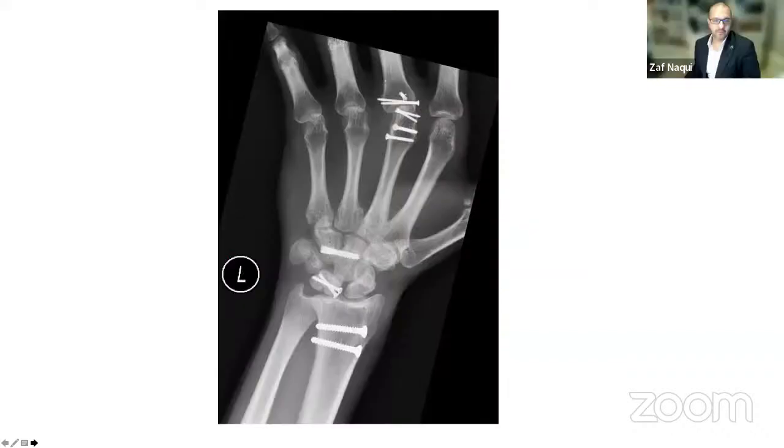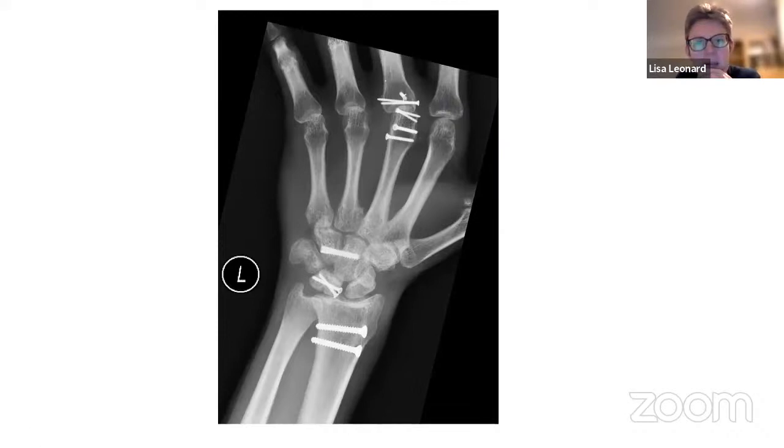So here we go. This is what was done. Lisa? Yeah, this was an entertaining day. It was quite hard work, but I think we were quite pleased with what we got in the end. You're absolutely right, Lindsay, it was a bugger to fix that lunate, but they'd come from Ukraine with K-wires everywhere. The whole thing had just been K-wired, and so we just took all the K-wires out. It was quite difficult to get the fracture fragments to align on the lunate, but then we got two cross screws and that held it quite well.